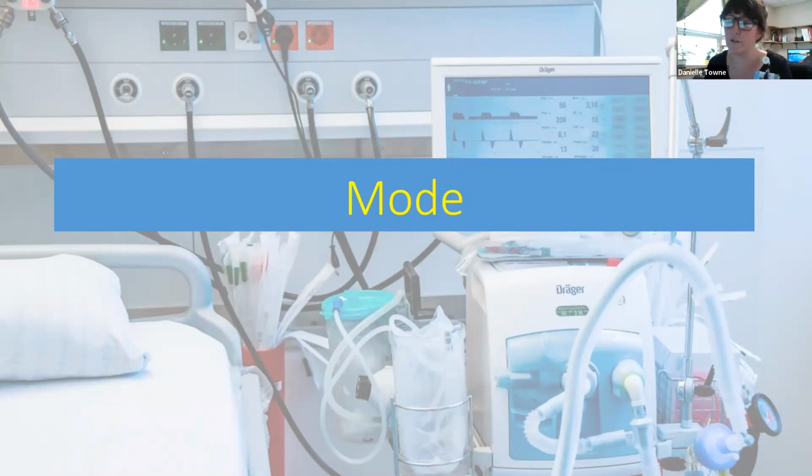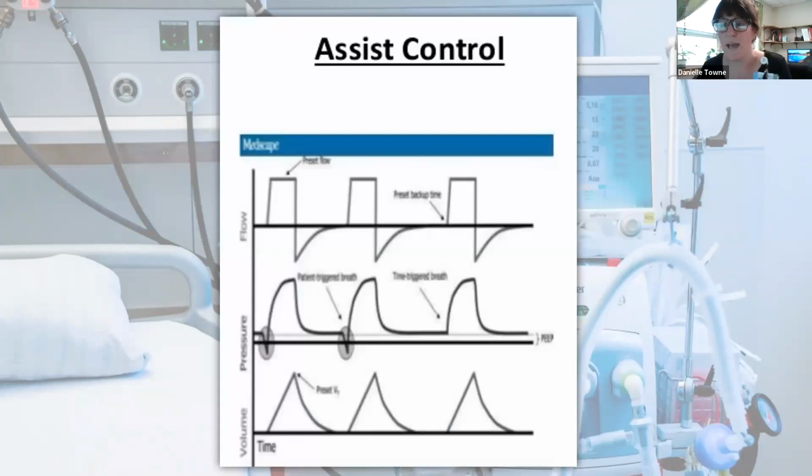But assist control and SIMV are the two that I really want to make sure people understand the difference. So in assist control, every breath given is exactly the same. The ventilator controls every breath in order to reach its targeted goal, whether you set that goal to be volume-based or pressure-based, every breath will be identical. If the patient does not trigger a breath, the ventilator will just deliver it at the preset rate that you put in, right? But if the patient does trigger a breath, that breath is going to be assisted to reach the set target, whether that was a set volume that you put in or a set pressure that you put in. So what does that mean?